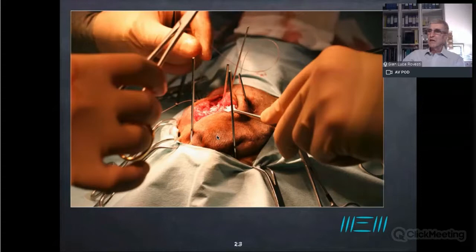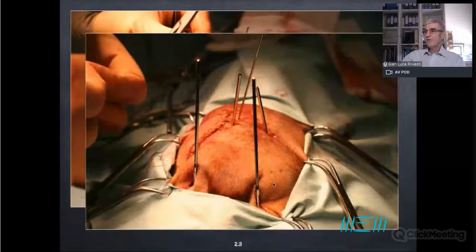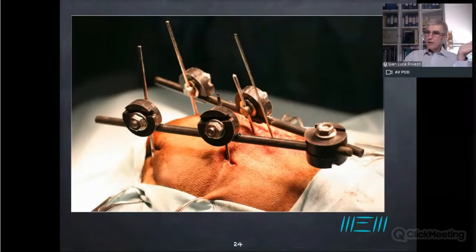And once we have those pins put in position like this, we just connect with the polylock fixator that is a radiolucent one with the carbon bars and plastic clamps, and we will see the difference for the interference for radiographic examination. This is a standard conformation.